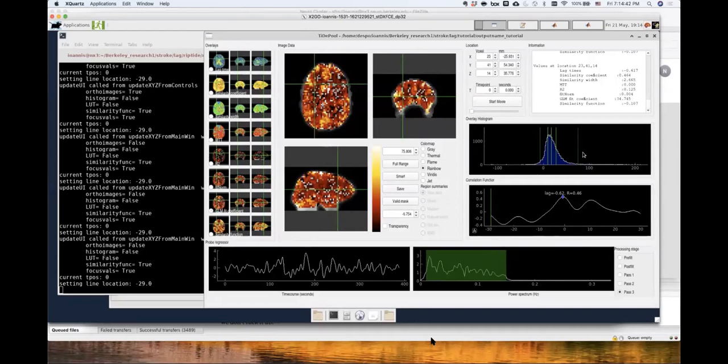So that's sort of the lag time, as you can see right here, that I'm going to spit out. And I think this is a nice overall view of the data that's been produced by RapidTide.